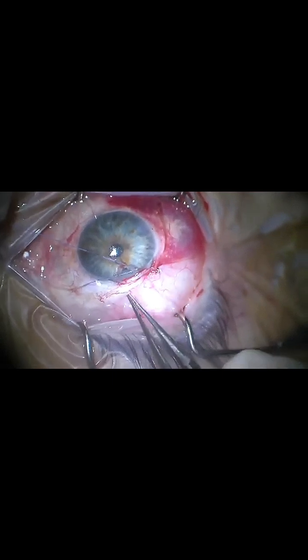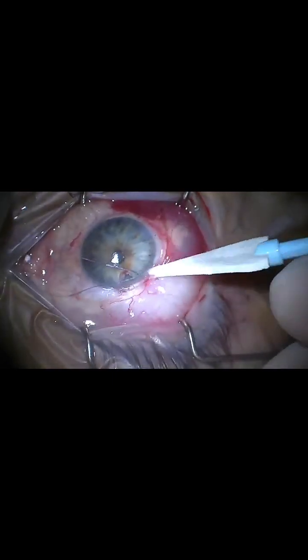Gentle pressure shows easy elevation of the bleb. A Weck-Cel is used to confirm a watertight closure.